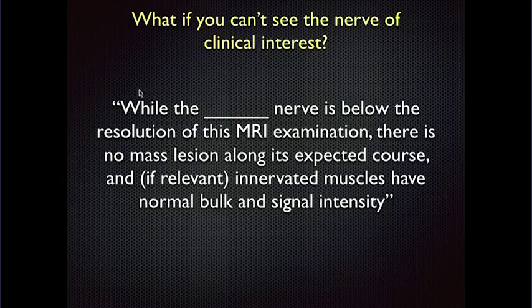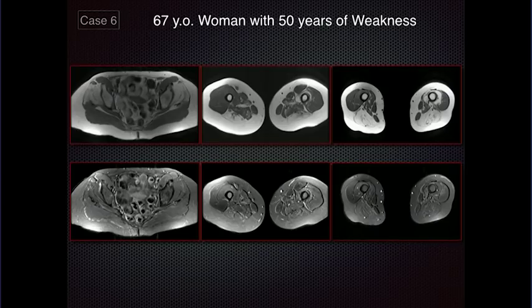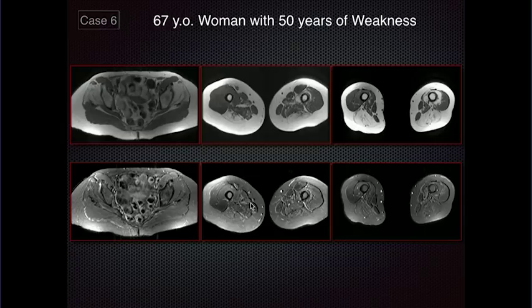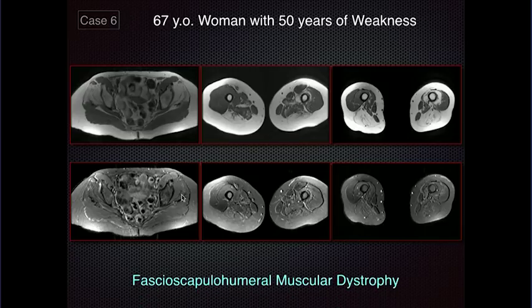What do you do if you can't actually see the nerve? Typically I say something like: while the blank nerve is below the resolution of the scan, we don't see a mass lesion along its expected course. Then look downstream to see if the muscles have normal signal intensity. Here's a case with atrophy involving gluteal musculature and hamstrings bilaterally with deep quadriceps on the left. There's not much edema, just tremendous atrophy — going along with 50 years of symptoms. The point is that not everything is a nerve problem. This is actually a myopathy — fascio-scapulohumeral muscular dystrophy — involving muscles but not necessarily nerves.